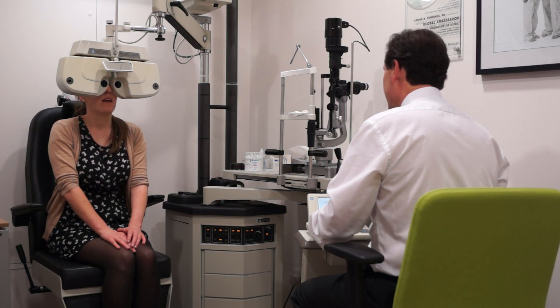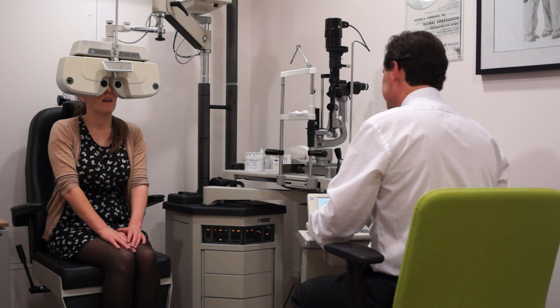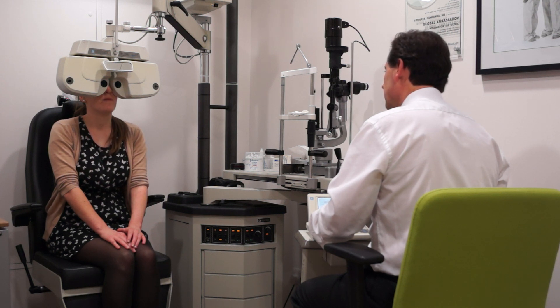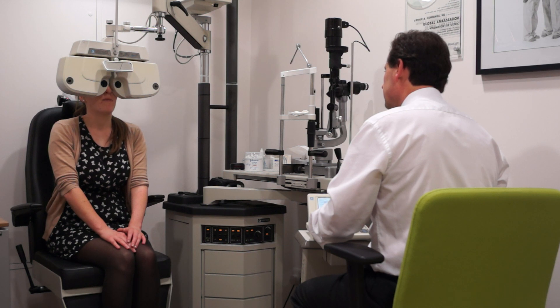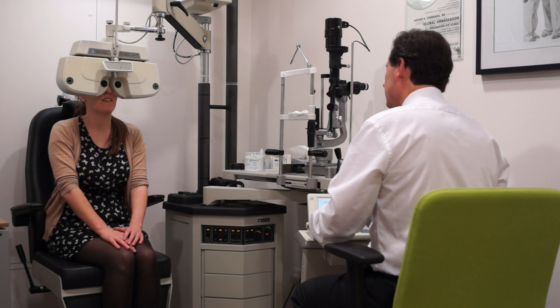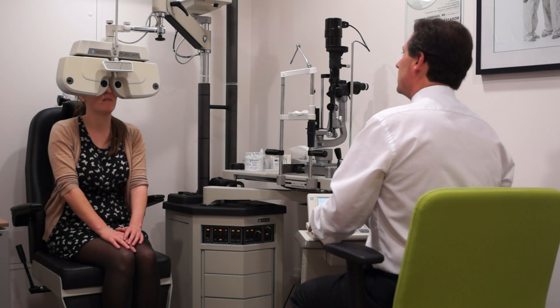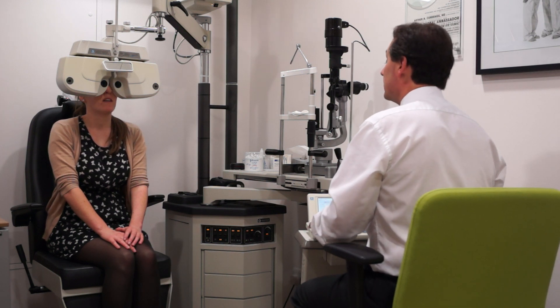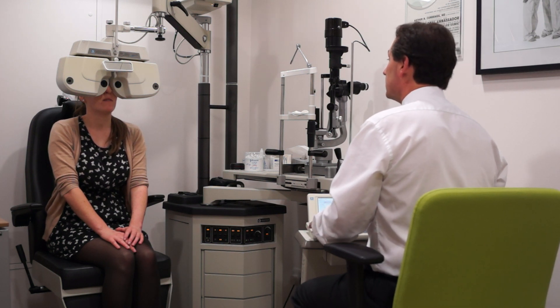So if this is 100, what do you think this drops down to? I'd say 60, 70. All right, so that's suggesting very strongly that you don't like monovision.